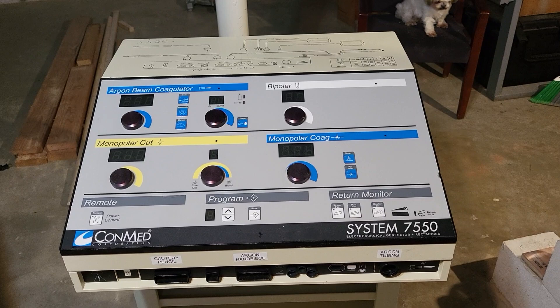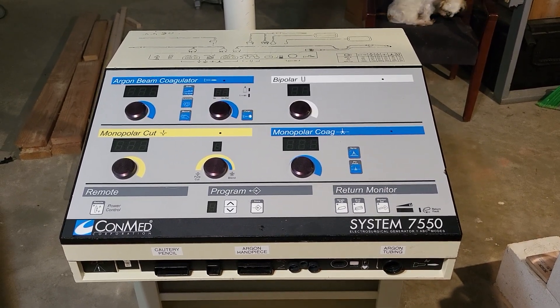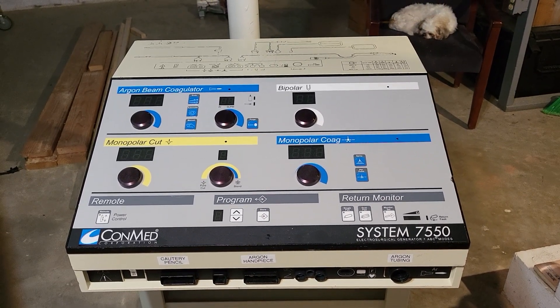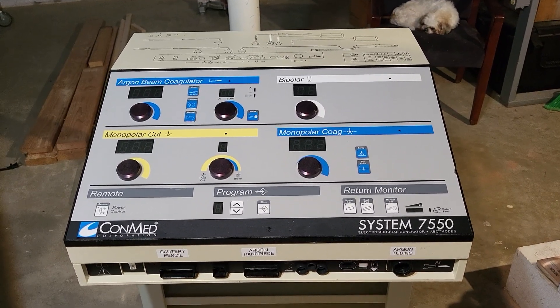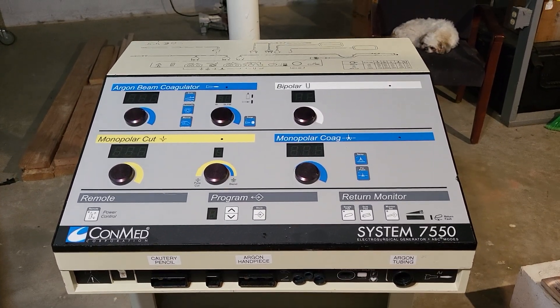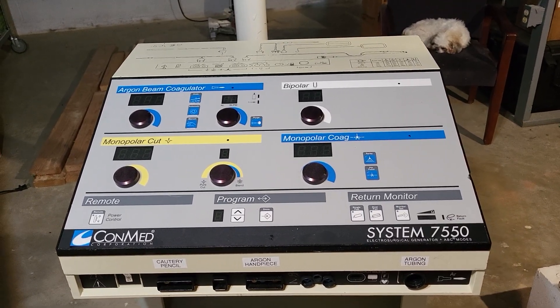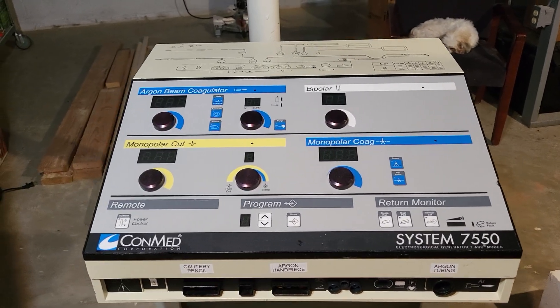This system has been around for quite some time, and I remember learning about it at ConMed when I went to technical training, but that's been a long time ago. What we're going to do is take this unit, open it up, expose all the internal components, and we're going to build a trainer.